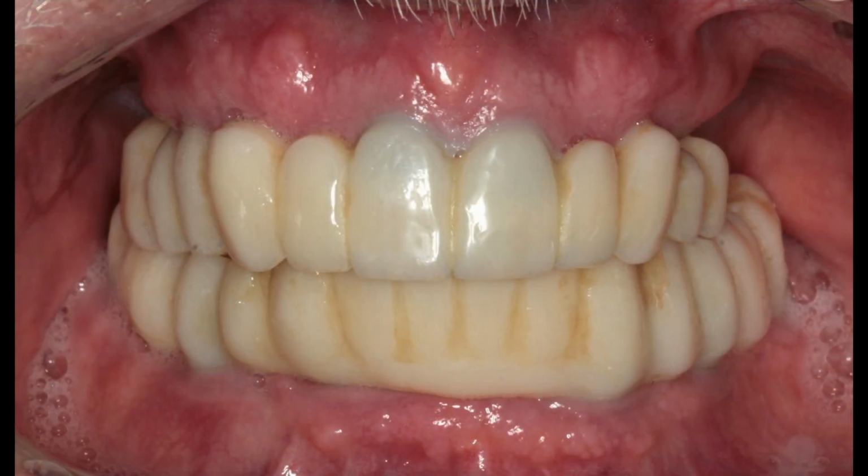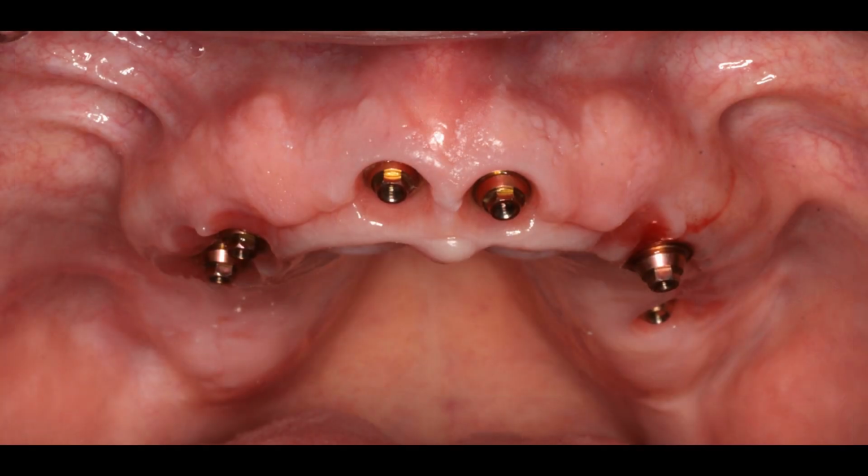Here are the temporaries 3 months later. And again, I'll just keep pointing out that only the slightest tissue remodeling has happened over that 3-month period. And from this point forward, it should be stable. Pointing out again the beautiful soft tissue contours and the health around these implants because they were placed properly without bone removal, and the temporary did its job perfectly.